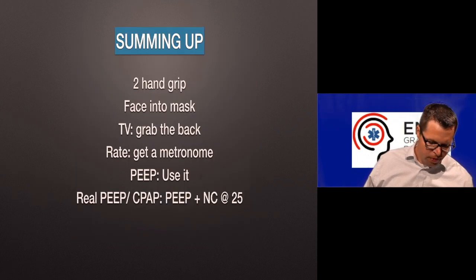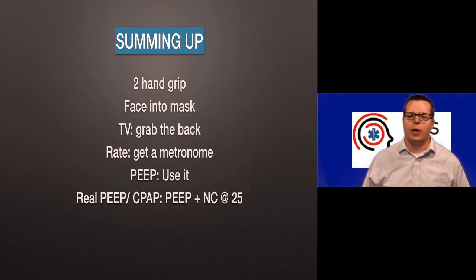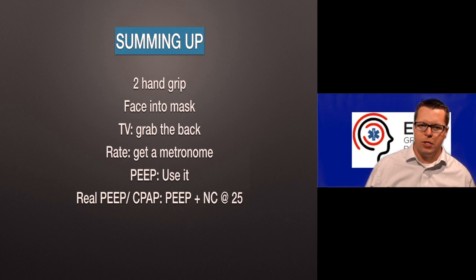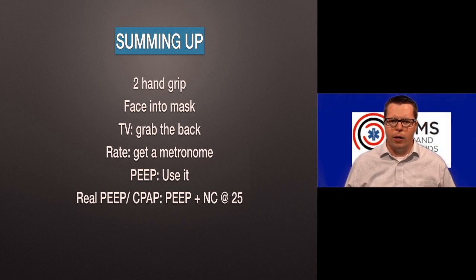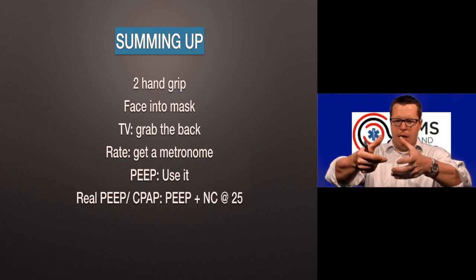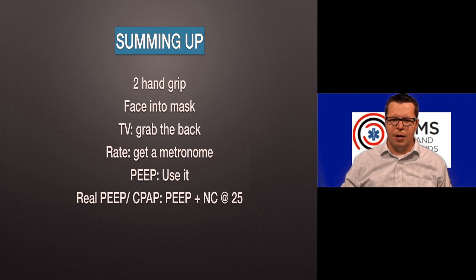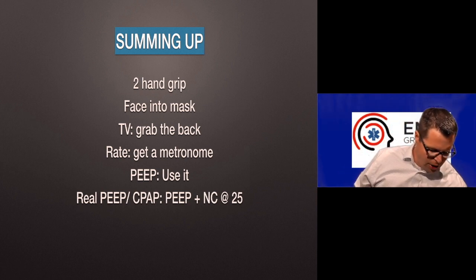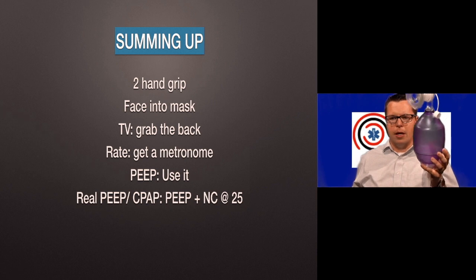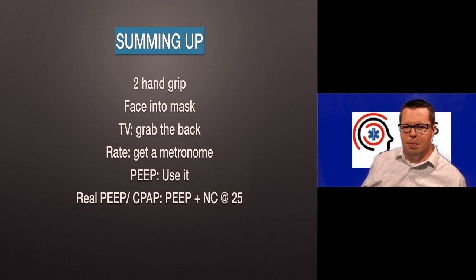So to sum up, if you are using the bag and you are using a face mask, make sure you use a two-hand grip and have good patient positioning, because that is super important for safe ventilation. If we are going to use the CE grip, then make sure you're grabbing the face and lifting it up. Likewise, if you're using the thenar eminences, grab the jaw and lift up into the mask itself. For tidal volume, change the way that you hold the bag. You don't have to empty the whole bag each time. Just squeeze a little bit of it. Use 2 or 3 fingers, and you will get plenty of volume in, especially if the patient's intubated.